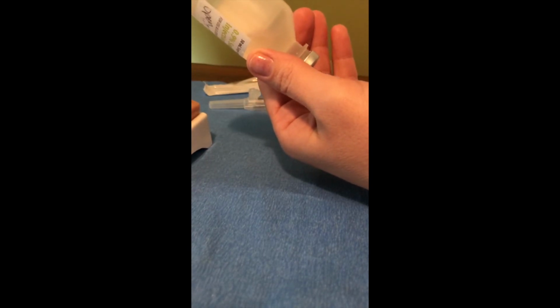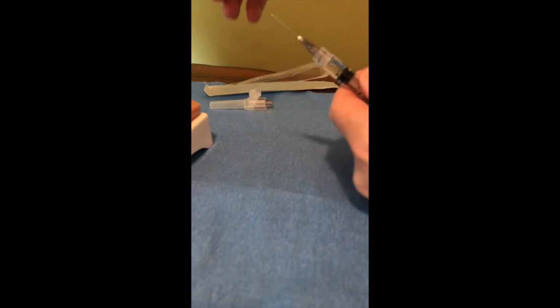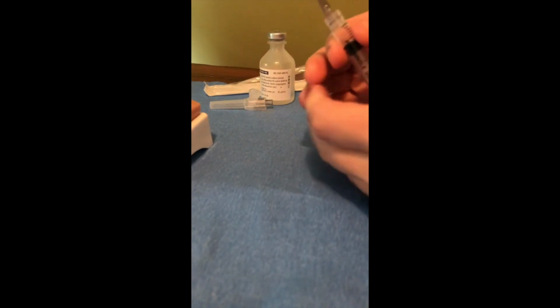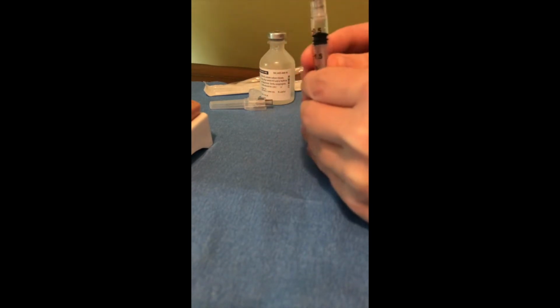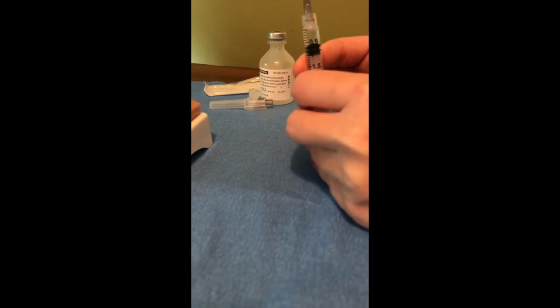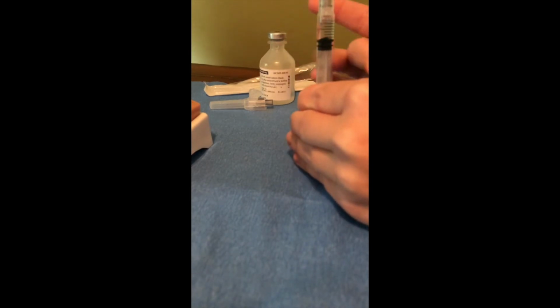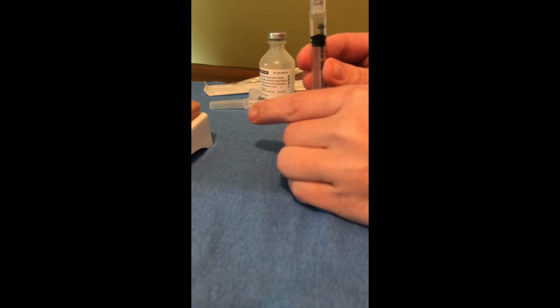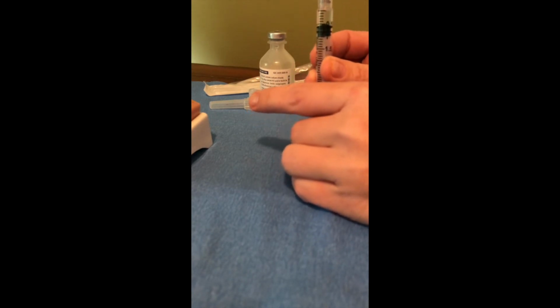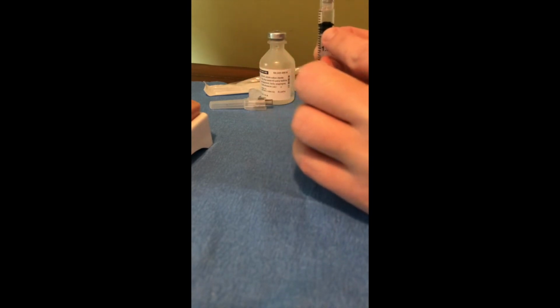I pull back just a little bit more than what I actually need because that's going to give me room to get any air bubbles out without losing any medication. So, usually I just go ahead and pull all the way back out. You may have to give it a good flick or two to get the air bubbles out. Then I go straight up until my little black line is on the 0.5.